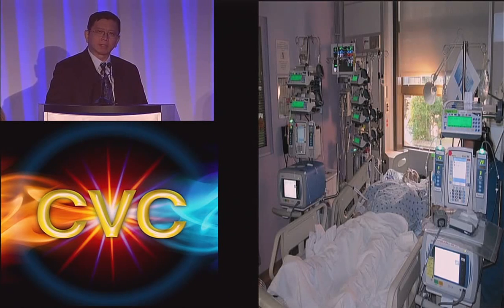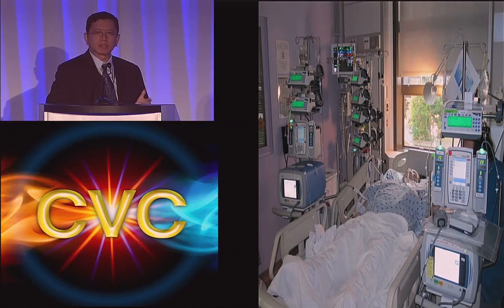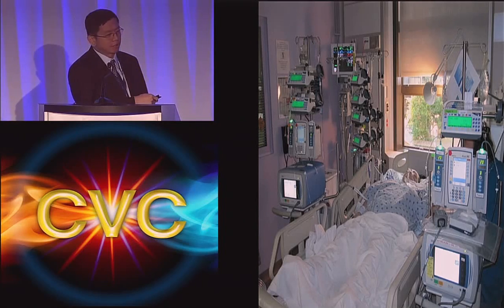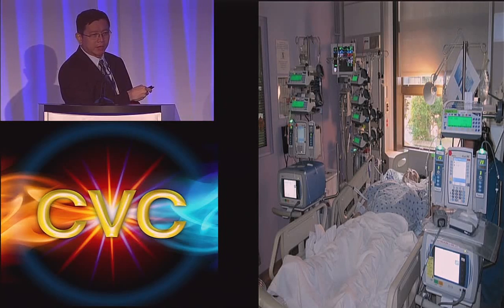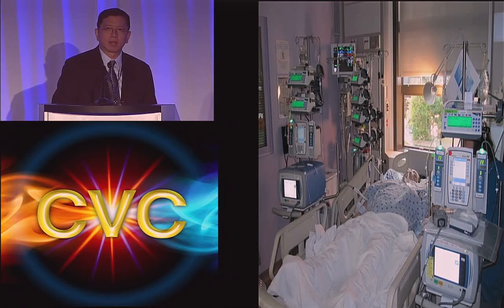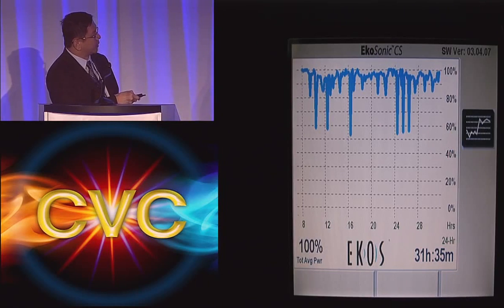And this is how they typically look. They are very sick. These patients present with heart rates in the 150s and blood pressures in the 80s over 40s, and they're in the ICU with multiple drips, as you can see here, trying to sustain their blood pressure. You can see here there's an EKOS catheter for the right side, another EKOS catheter on the left side. They are on the vent, they're paralyzed, these are very sick patients. And then the machine can actually give you a readout. This is after a certain time. You can see the readout, the energy level, the output based on the time.